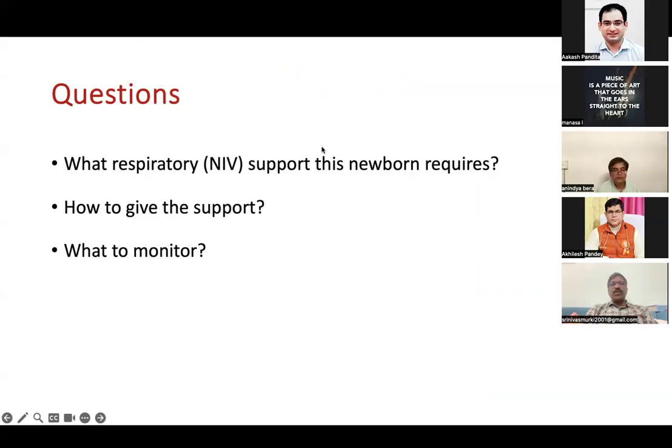So some of you have already told me that it is CPAP you want to give. And how do you give? Do you want to give bubble CPAP, ventilator CPAP, flow driver CPAP? So which type of CPAP do you want to give? You can write. Yes, most people would prefer to give bubble CPAP because bubble CPAP is the most cost-effective way of giving respiratory support for this baby.